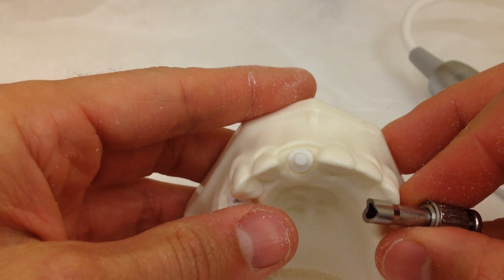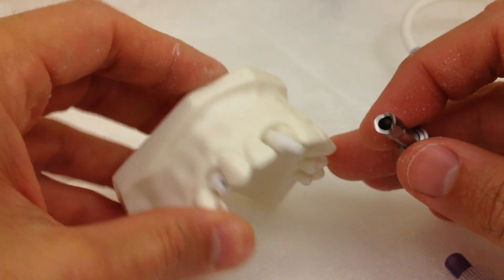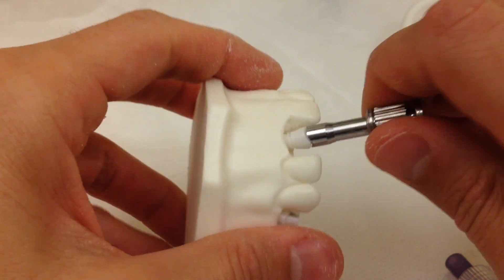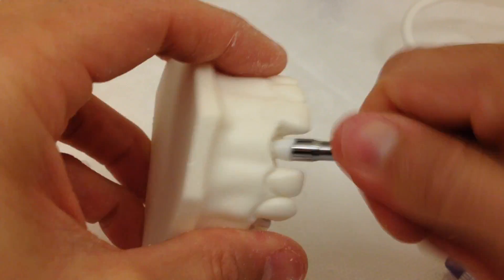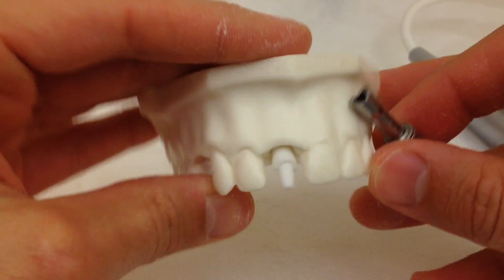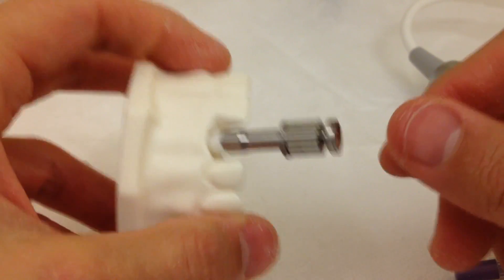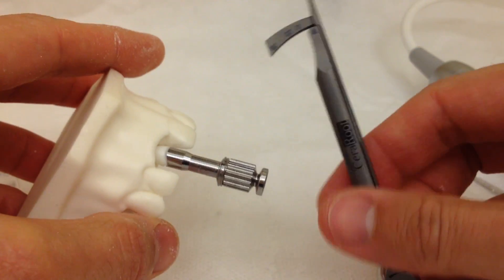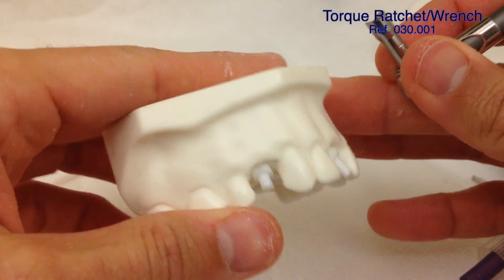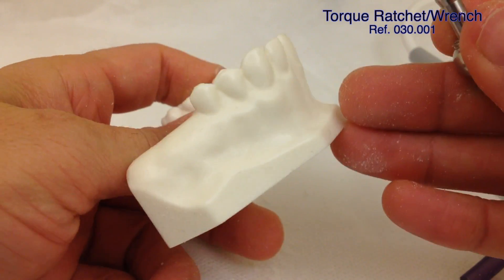You can start several turns by hand, and if you like the direction the implant is taking, switch to the contra-angle. I'm going to finish first with the torque wrench and then show how to do it with the contra-angle. Screw in as tight as you can with your hands, checking periodically that the direction of the implant is correct. When you reach too much force with your fingers, start using the wrench. The direction of the implant is pretty much the same as the other teeth.